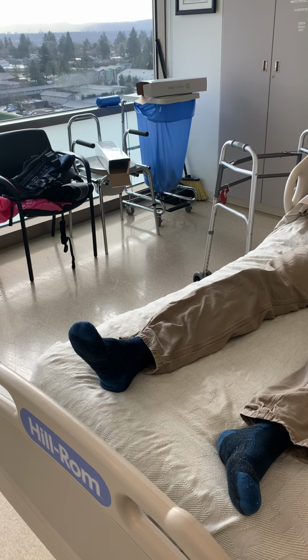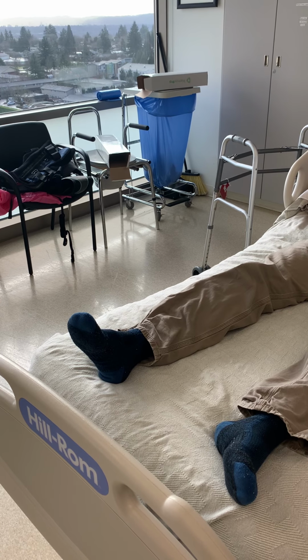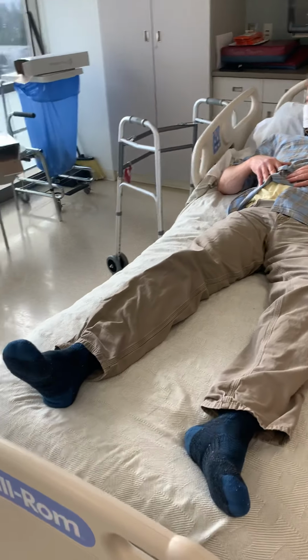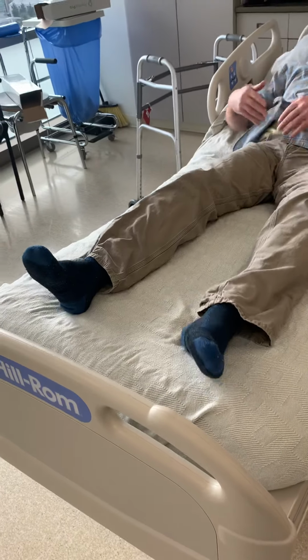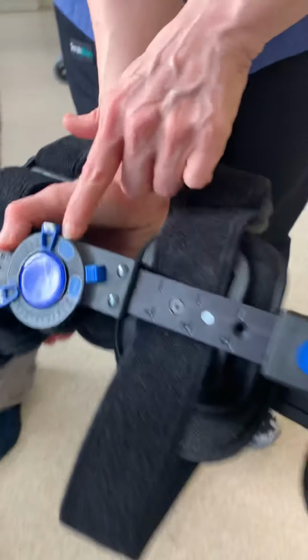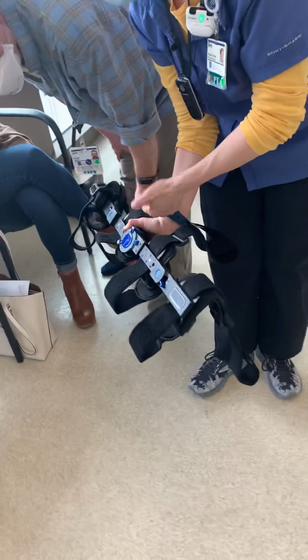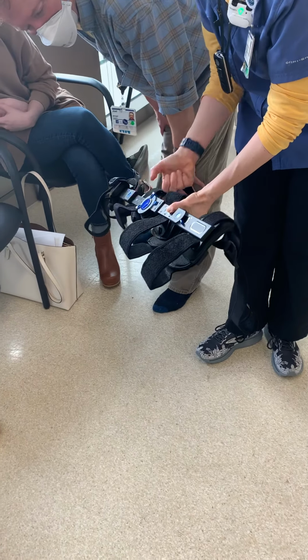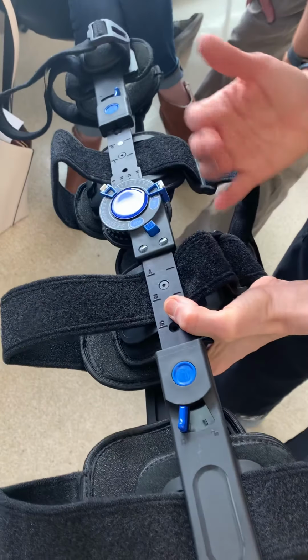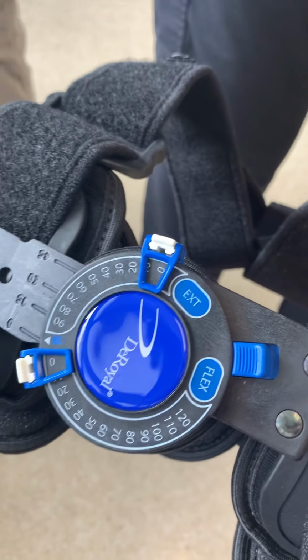There we go. The other thing you're looking at is, depending on what the surgeon put in the orders, what they want it set at for flexion and extension. On these dials, they're labeled extension on the top and flexion on the bottom. I was messing with this a little bit ago. These take a bit of work to undo. Most of the time the surgeons will have you at 0 on extension, but once in a while they'll have you do some weird setting, like they want it locked at 20 degrees.